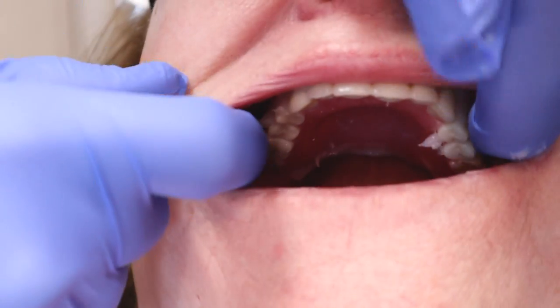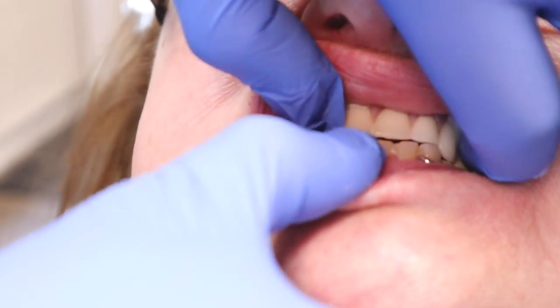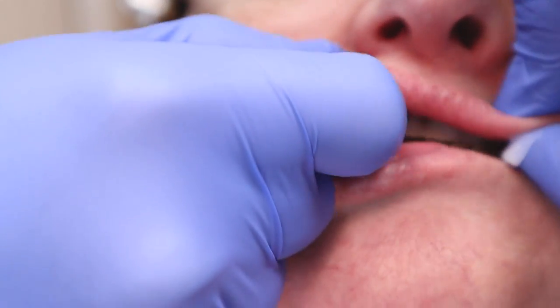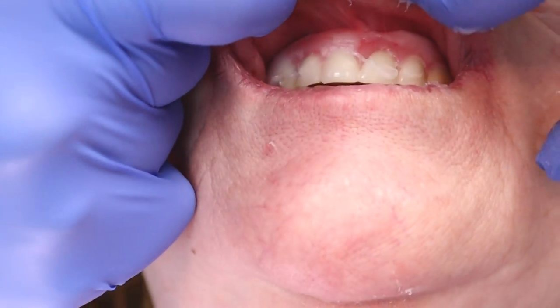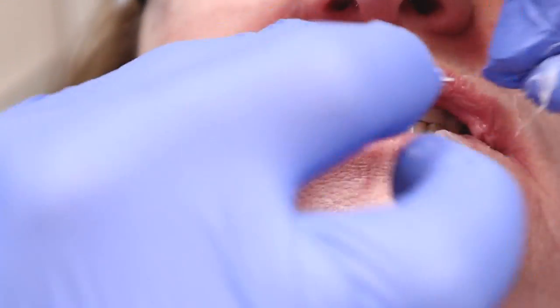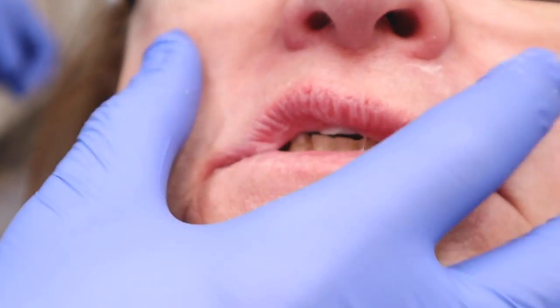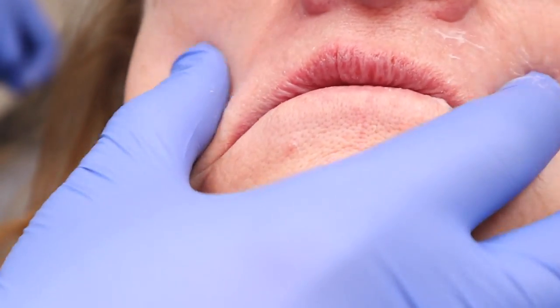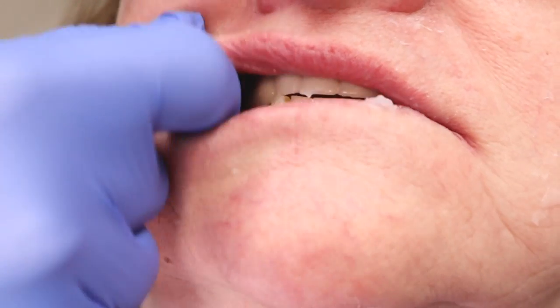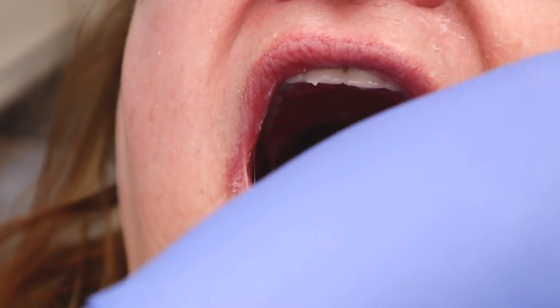I continue holding it in place and creating more border movements. You can ask the patient to help by biting down while you continue the border movements. I move the front of the denture to get the frenum visible in the tissue, and I move the lips as well. The maxillary arch is a little easier to work with than the mandibular one. I also ask the patient to open up and move their jaw side to side to help prevent overextensions. Some people have their patient smile and purse their lips too, but I like to assist and do some of those movements for them.